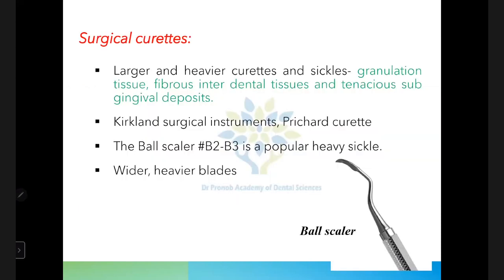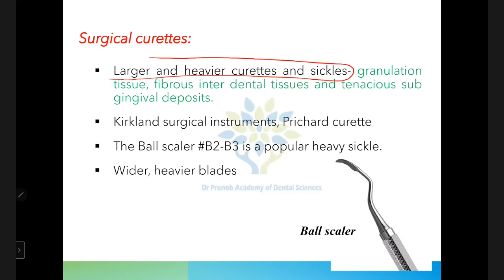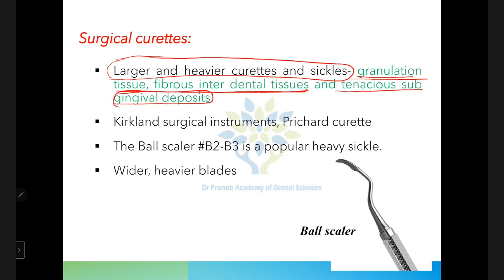Next are surgical curets and sickles. These are used for removing granulation tissue, calculus deposits, and fibrous interdental tissues. They include larger, heavier curets and heavy sickle-type scalers used for removal of tenacious subgingival deposits.